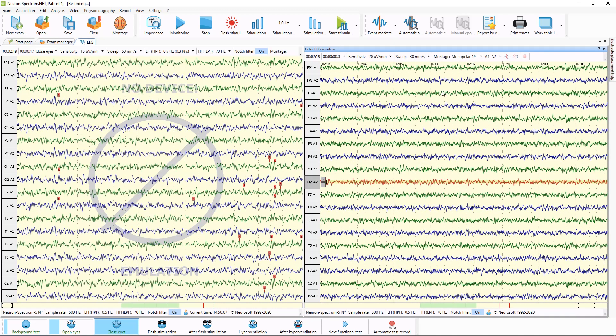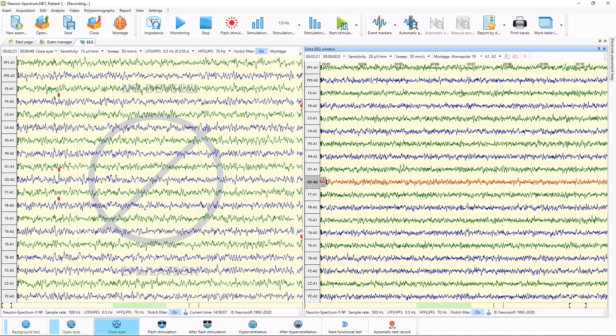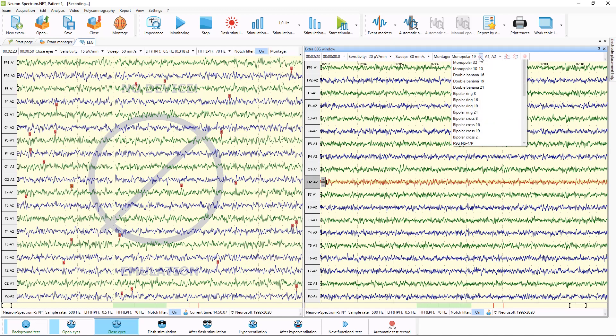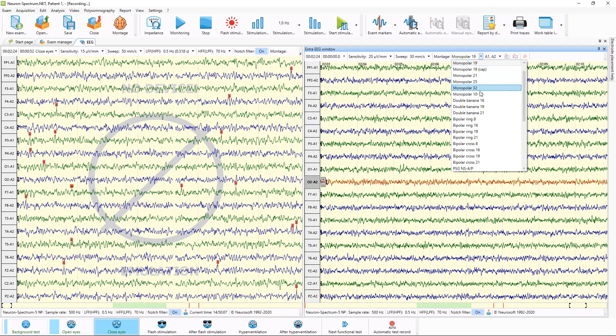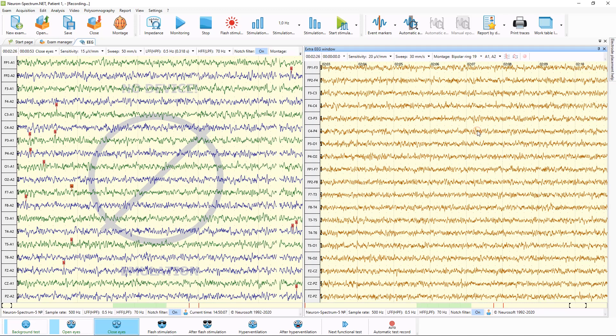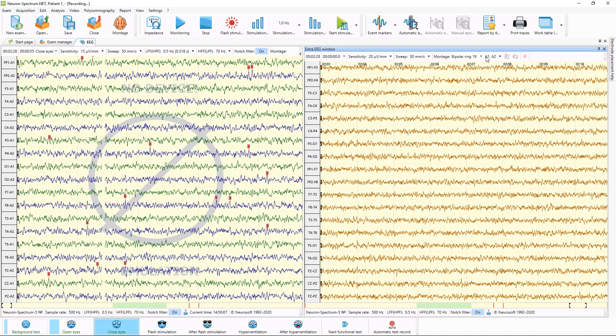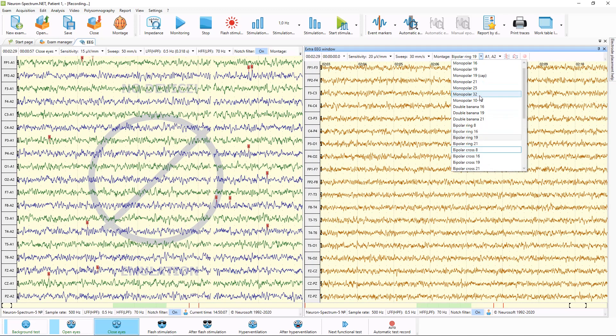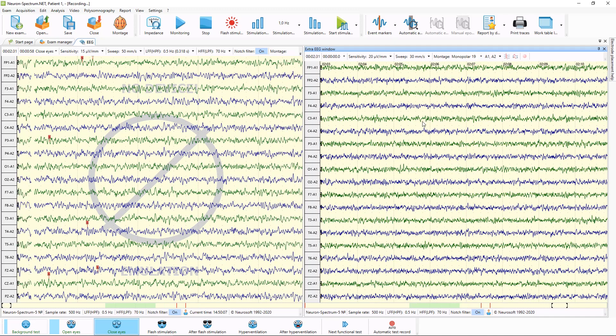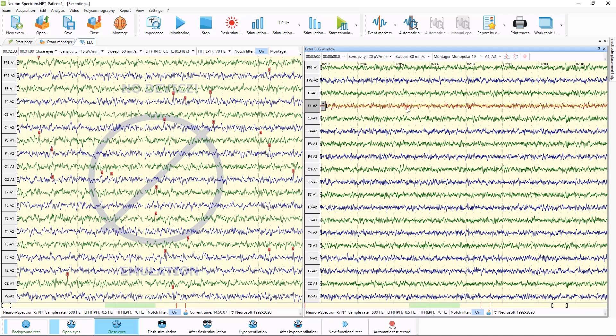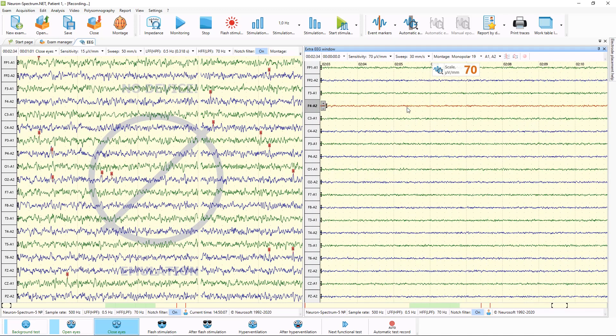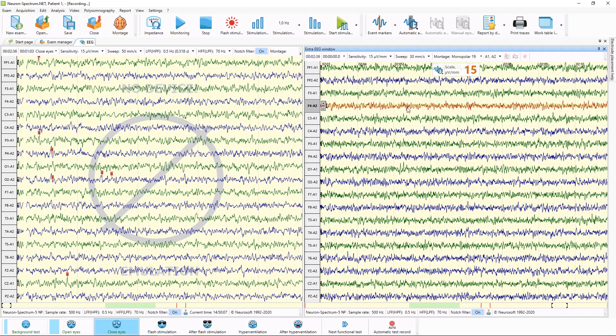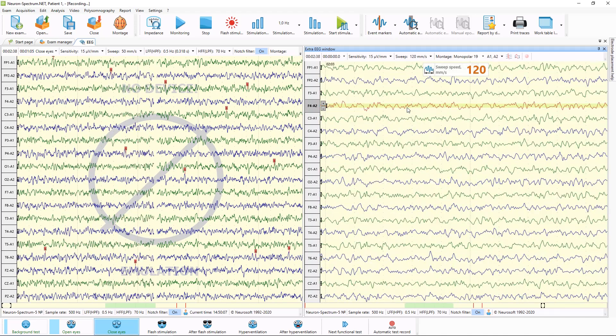And also here in review window, you can review traces in different montages, for example in some bipolar montages or monopolar montages, and change sensitivity and sweep speed separately from main EEG window.